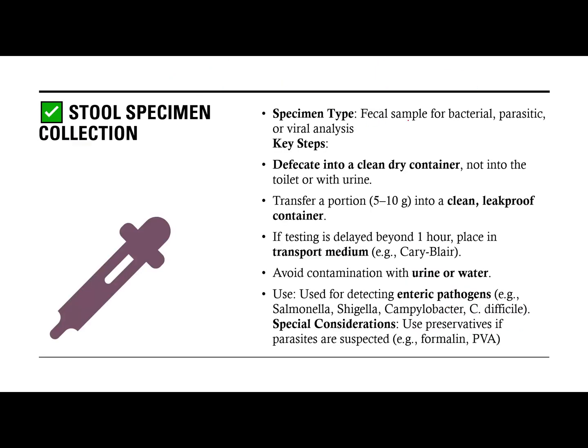Now, let's talk about stool naman. Now, you would test stool for bacterial, parasitic, and most important, viral analysis. There are certain viruses, class, that would cause diarrhea in children. That's why they would use stool samples. So you would instruct the patient to defecate into a clean, dry container, not into the toilet or with urine. I have encountered, class, patients collecting or defecating in ice cream tubs. So nilalagay nila, class, sa lagayan ng ice cream yung stool nila, and they would bring it into the lab.